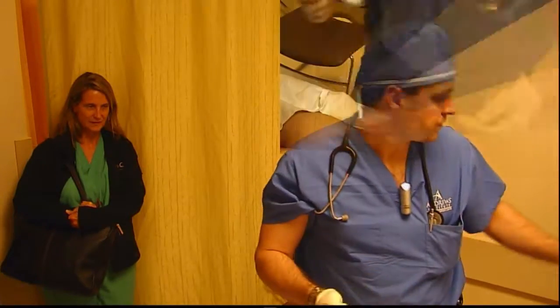Now, take that with a grain of salt because we are going to be using an echogenic needle to begin with, a Pajunk echogenic needle, and so you may not have as much on-off phenomenon with the needle visualization software from Sonocyte, but we'll have to see. We'll determine, even with an echogenic needle, if there's any benefit to that. So we'll go ahead and get started.